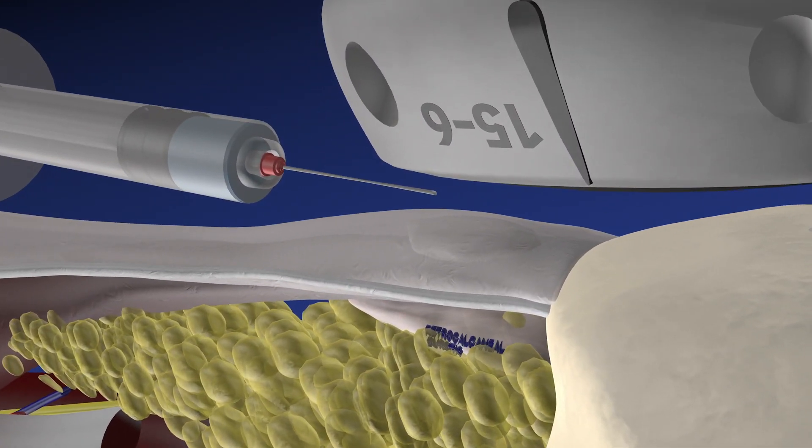Also during this procedure, the probe is in an axial plane so we can get a medial and lateral perspective of where the needle is. But in this demonstration, we only see the probe in a sagittal plane.